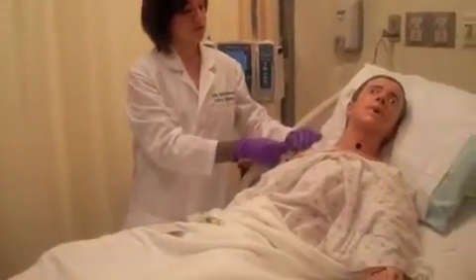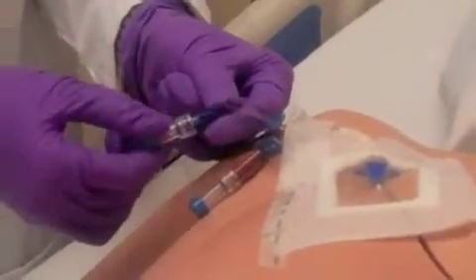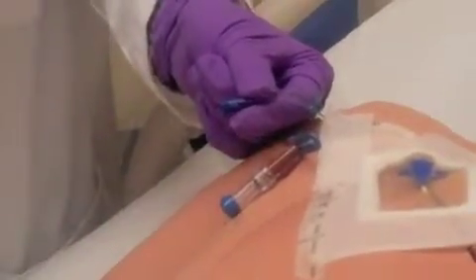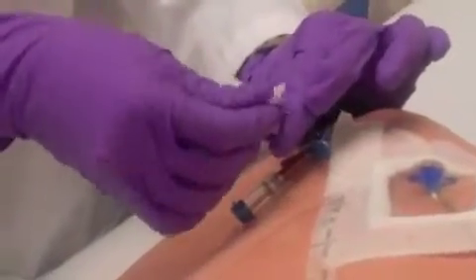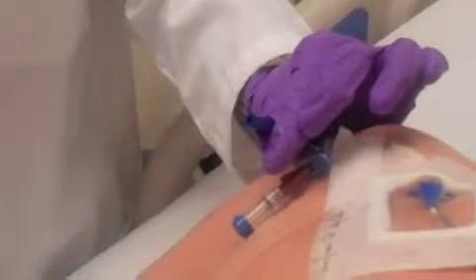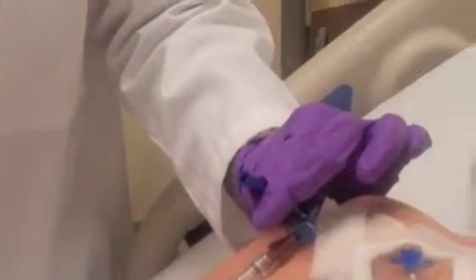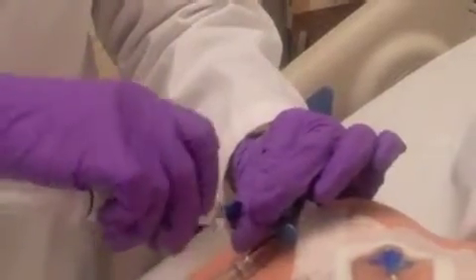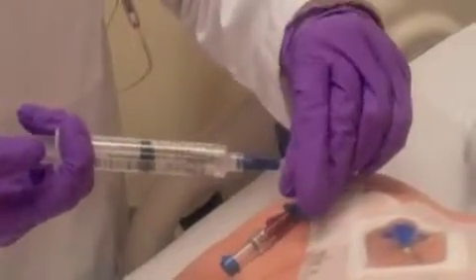So we want to make sure that his line is clamped with this blue clamp, and we remove the cap from the line. And we're going to use an alcohol swab to sterilize the cap or the line. We flush with 3 to 5 milliliters of normal saline. Make sure you unclamp the line first.